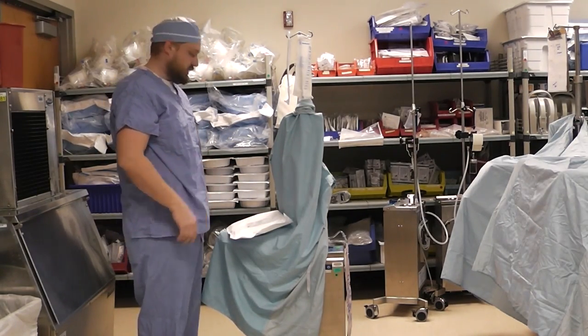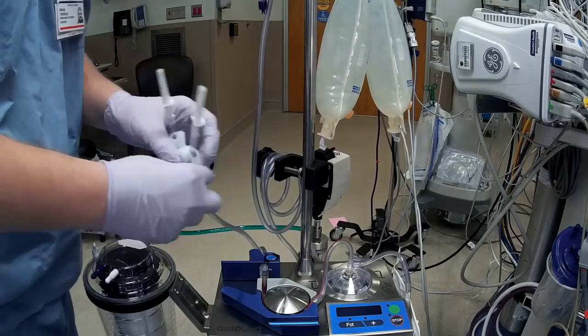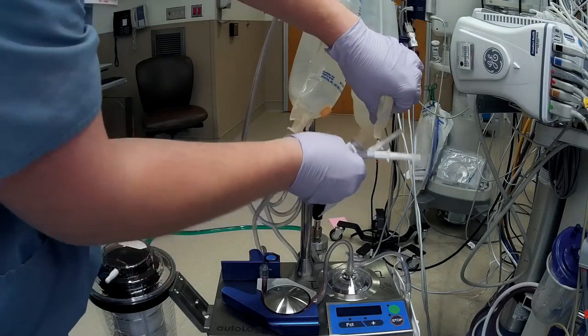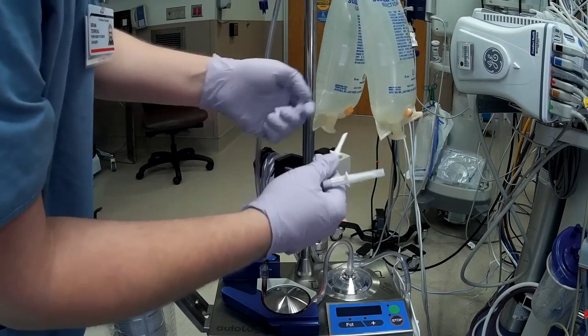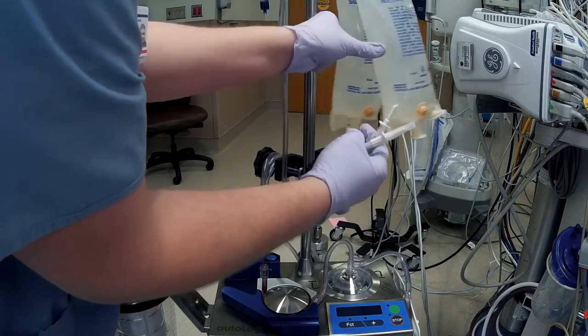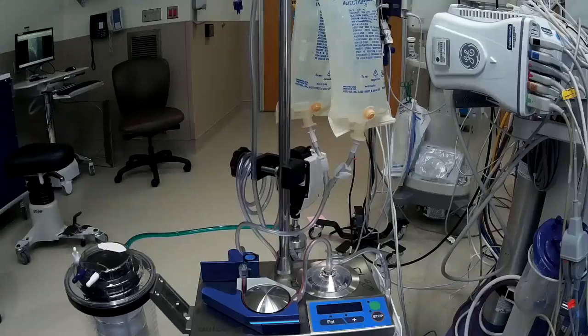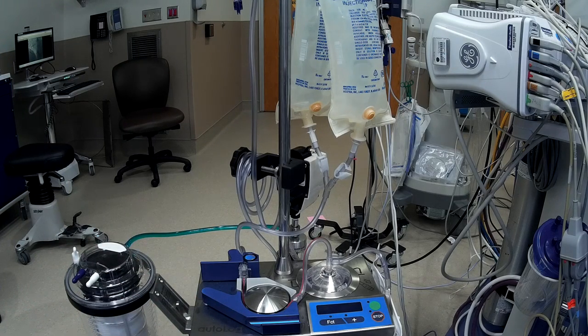This cell saver is now set up and ready to be used. Before we start using the cell saver, we must first spike some wash solution. At St. Luke's we use one 3 liter bag of saline; at Freighter they use two 1 liter bags of saline. Next we can turn on the machine, and also the cell saver's own vacuum if necessary. Otherwise, we can hook up a separate vacuum line to make it quieter.